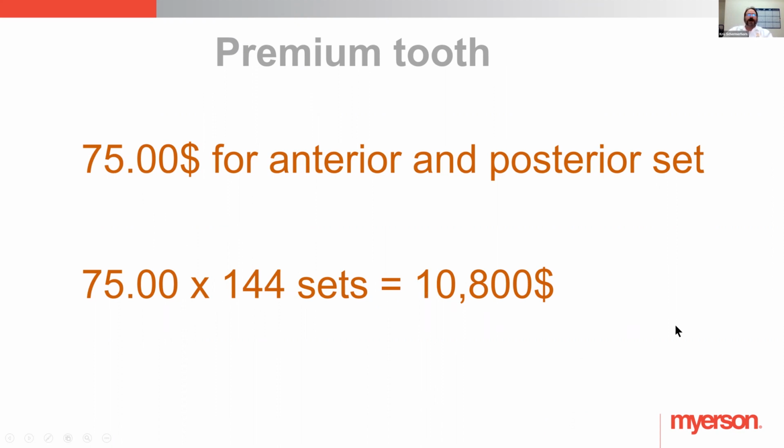I would put Trusana in the level of functionality probably above the higher quality teeth, by the information we started with. Aesthetically, if you're just high shining it, I would put it in the mid-level range, because it is a monolithic material. But if you OptiGlaze it, now you're putting labor in to OptiGlaze, but I think you're still coming out ahead, and I think you're at the level of a premium tooth at that point, as you could see in the previous slides. There's debates on different things there, and you can settle in on where you would be. There's some debate on how long OptiGlaze lasts.